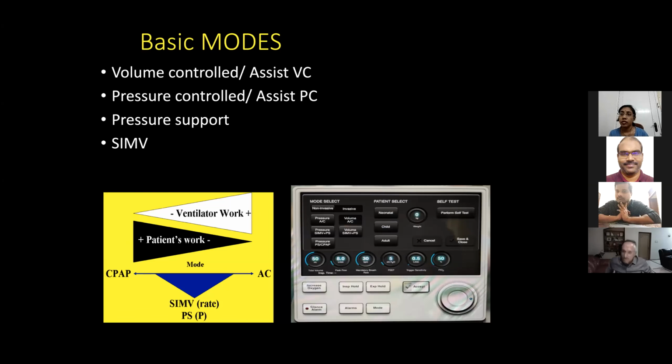These are the basic modes and their usage. SIMV is a mode which should not be used. I will tell you why. We'll go there, but this is how the panel looks. You remember this. This is how the panel looks.